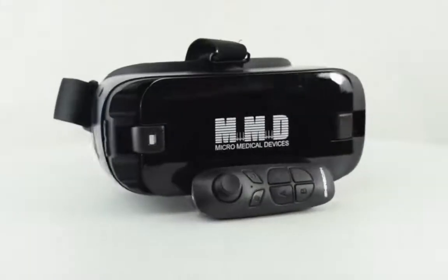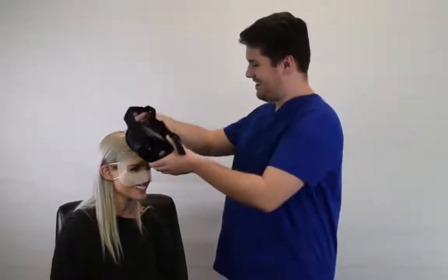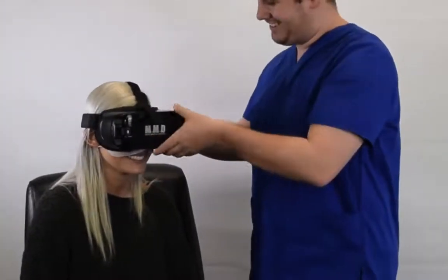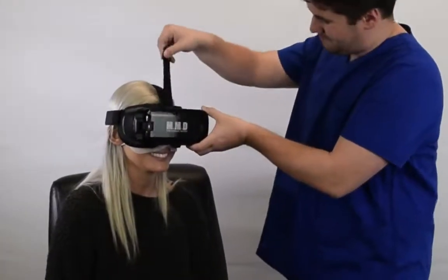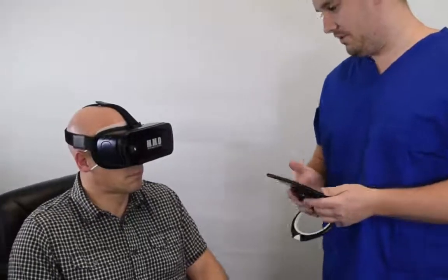The VF2000 is compliant with ADA regulations in the United States because it can be operated from the position in which your patient is most comfortable. And because it doesn't need the patient to hold their head and neck in an unnatural position for an extended period of time, it's ideal for use on patients who are elderly or have disabilities.